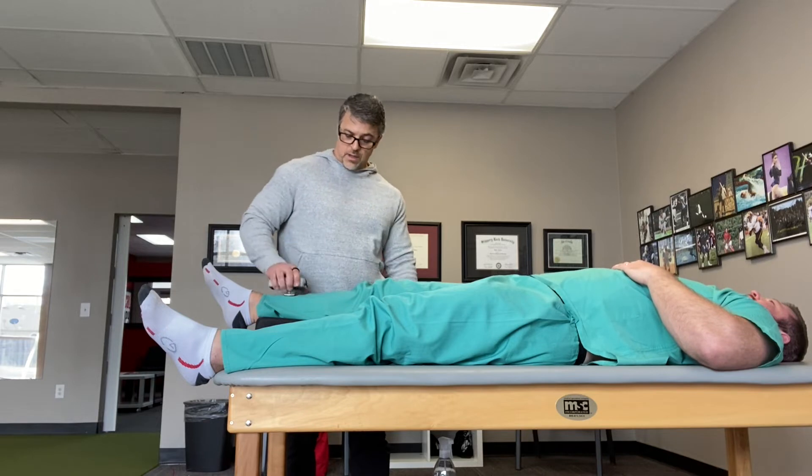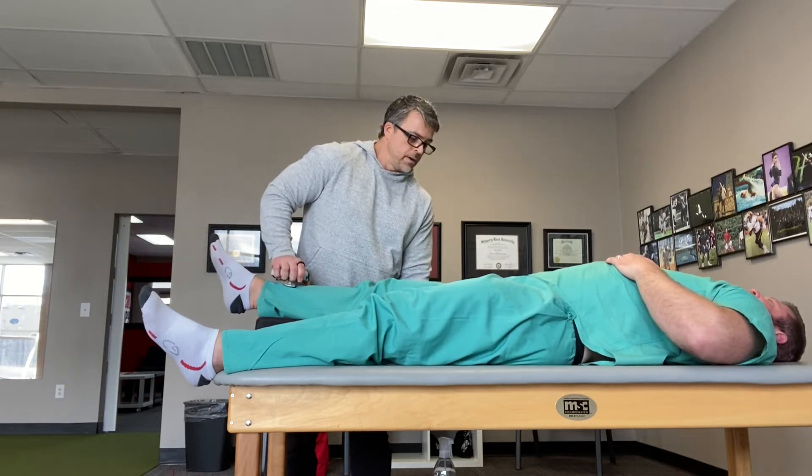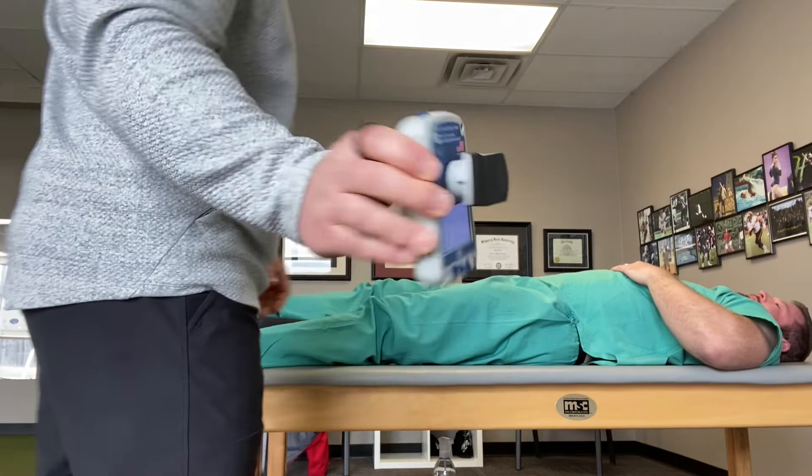We're going to go again. Push as hard as you can. Go, go, go, go. Good. Okay, so 46.6. Alright, so there's our pre-Theragun measurement.